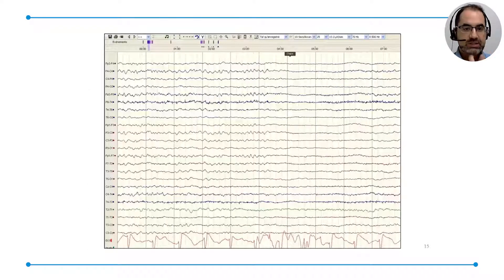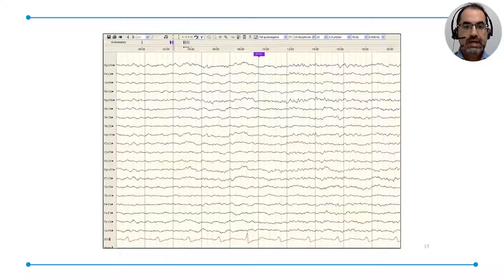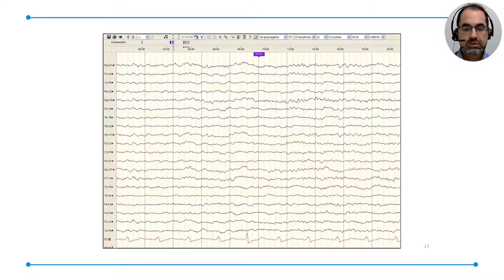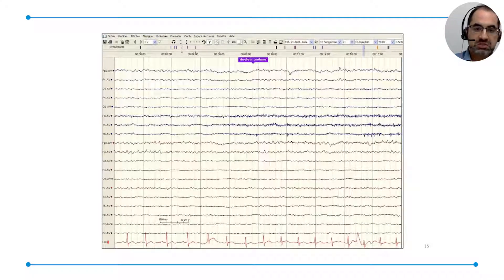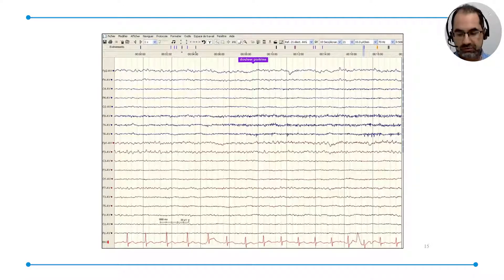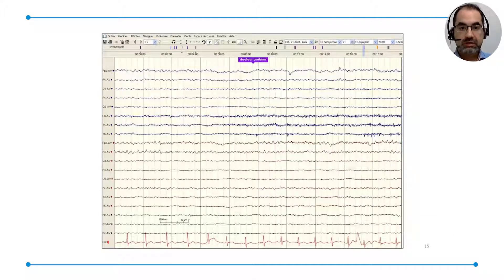Let's come to reactivity. Some examples here are taken from patients during TTM and sedation. Here, a continuous background is interrupted by clapping hands next to the patient. Here, a slowed background accelerates upon noxious stimulus. And here, at first glance you might say there is somehow reactivity — maybe a higher amplitude in the frontal leads — but look, there is no reactivity. Upon painful stimulation, this is an alpha coma, predicting a poor outcome. So continuity of the background is important, but you have to integrate it with reactivity.